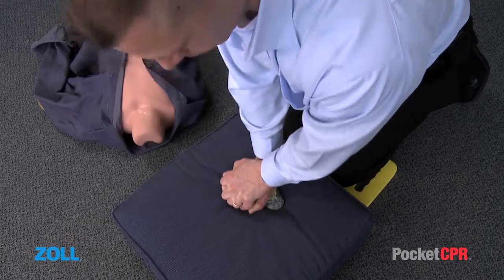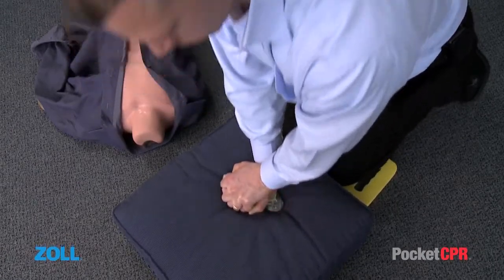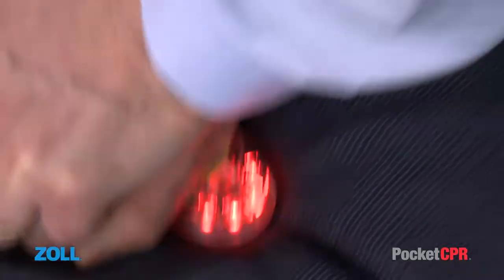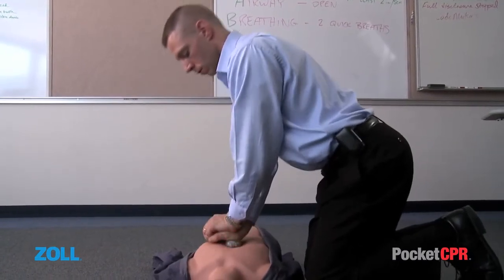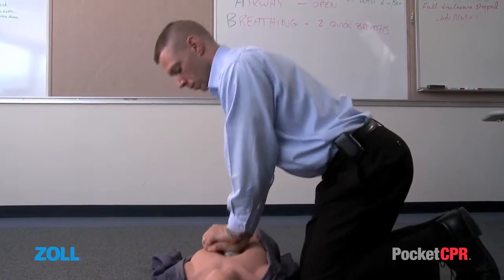Training with the PocketCPR may be done using a mannequin or resilient cushion. When chest compressions are started, the device will measure the compression depth and rate and give feedback on whether the compressions are good or the rescuer needs to push harder or faster. The rescuer should push hard each time the metronome sounds and should keep his or her arms straight to minimize fatigue. Don't be afraid of pushing too hard.